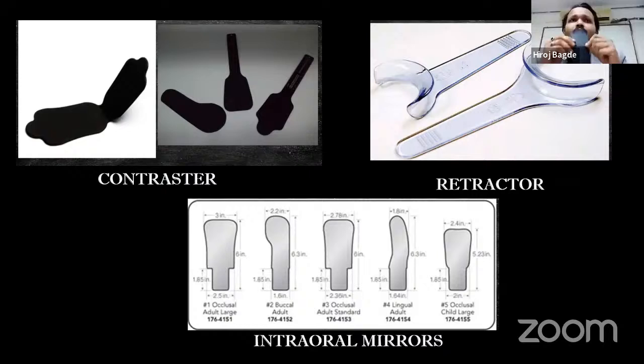Second suggestion will be a stainless steel mirror, and the last one would be a normal or plain mirror, which we get through the market. The problem with that mirror is that scratches are very common. Second, we have something called a duplicate image or a ghost image along with it. So we have two images whenever we click. That is not advisable. So we need to go for intraoral mirrors which are rhodium coated.